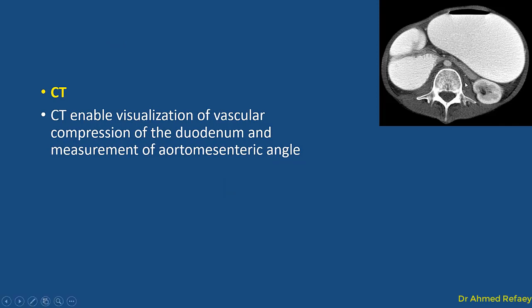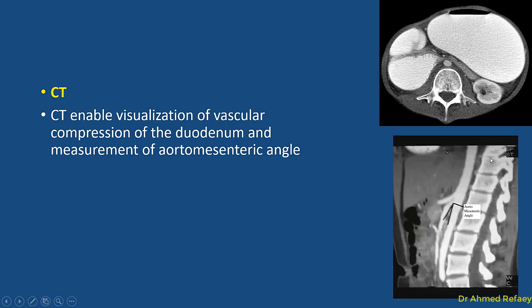By CT scan, we can see marked proximal dilatation of the stomach and the second and proximal third part of the duodenum, with distal collapse of the third part of the duodenum at the region of the superior mesenteric artery. On sagittal reconstruction, we can easily measure the angle between the aorta and the superior mesenteric artery, which will be less than 22 degrees.